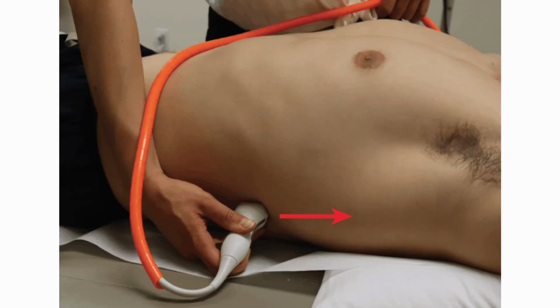Now we'll move on to the left upper quadrant. So left upper quadrant is somewhat similar to the right upper quadrant, but obviously on the left side. It's a much more difficult view though. In this view, I always advocate for getting your probe all the way down to the bed. The spleen renal interface that we're looking at is often very posterior. So really I start with my hand down the bed, and it's often higher up more towards the head than the right upper quadrant area is.